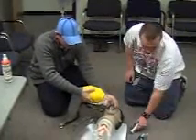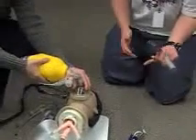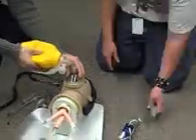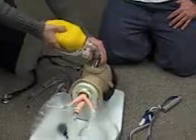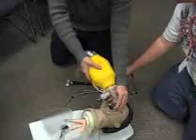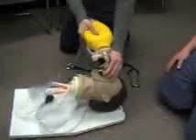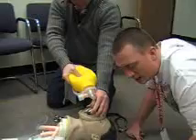As he is pre-oxygenating, I'm going to set up my equipment and check it. I'm using a number three Macintosh — my light is tight, white and bright. I'm going to determine tube size for this patient based off of one of his nares or his pinky size. Based on this patient I would say that he can take a size seven tube. I've got my stuff set up for intubation and I have determined that there is a need.